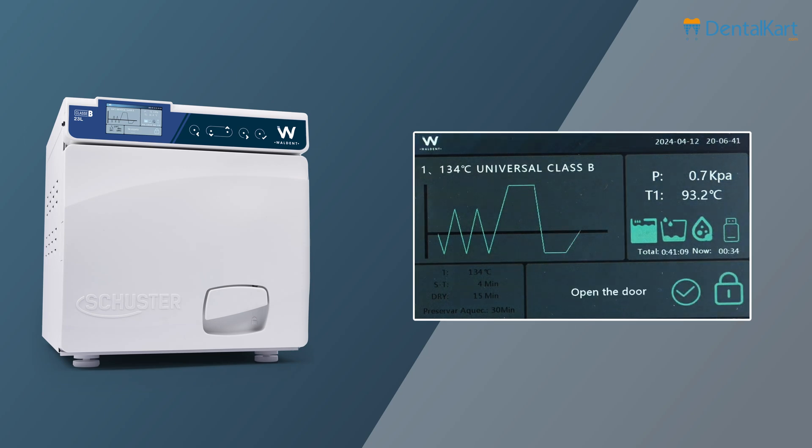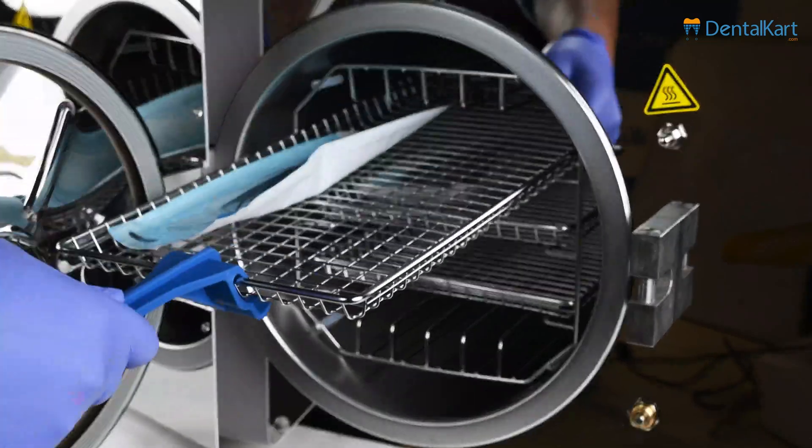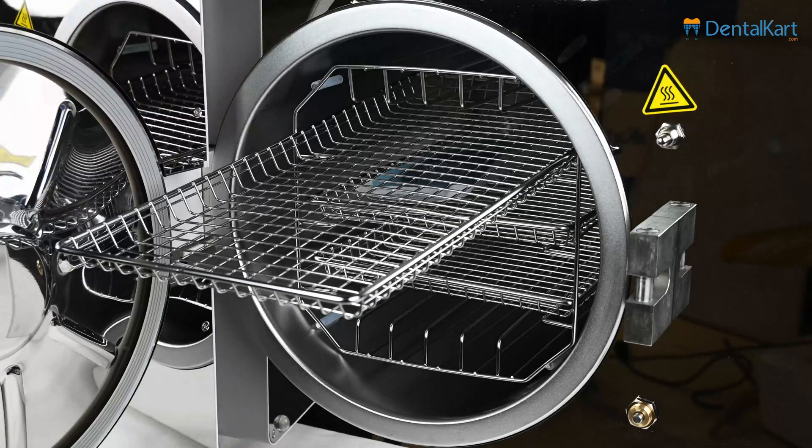At the end of the cycle, the display will show 'open the door' with an alarming sound. Do not open the door until the pressure is less than 10 kPa. Once the pressure level is correct, open the door and unload the instruments from the chamber.